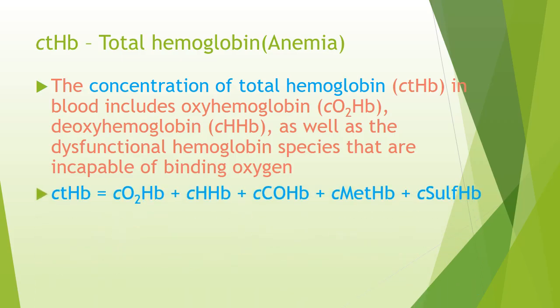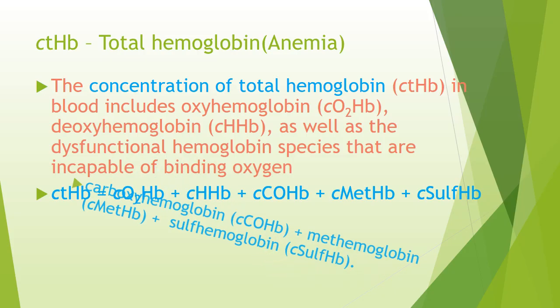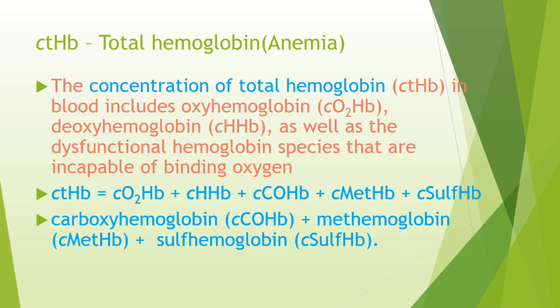Once again, the total concentration of hemoglobin, CTHB, will be equal to oxygenated hemoglobin CO2HB plus deoxygenated hemoglobin CHHB plus carboxyhemoglobin plus methemoglobin plus sulfhemoglobin.